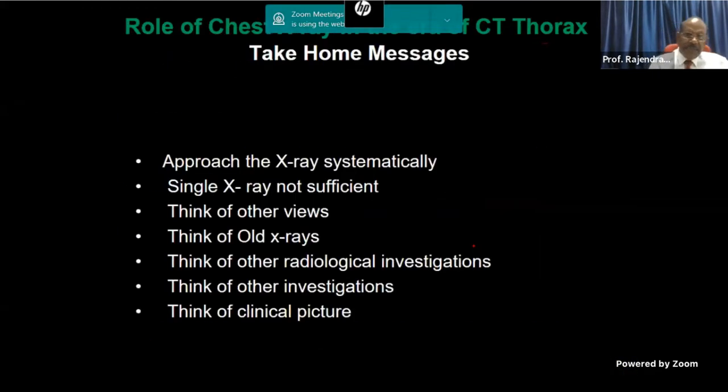Today, basically, I dealt with how to approach a chest X-ray. And my take-home message always has been, you must look at the chest X-ray systematically. If you are a very experienced person you can afford a global look, but if you are not very experienced, then you must look very systematically, at everything, technical points as well as anatomical points. And sometimes a single X-ray may not be sufficient; sometimes other views are required.